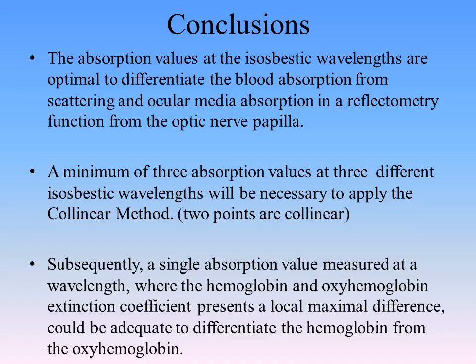But that is good for the optic nerve right now. I don't know; it's necessary to check what happens with the artery and vein after.